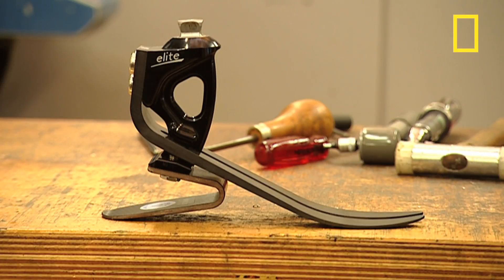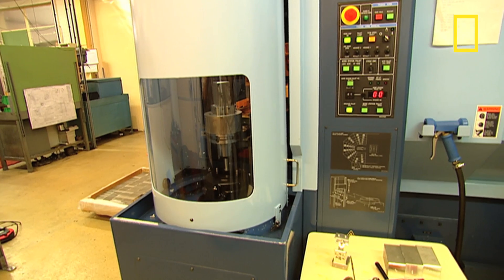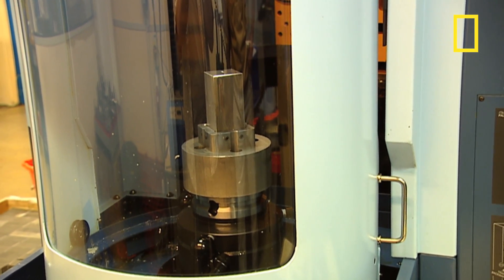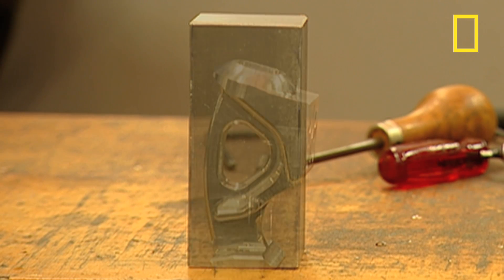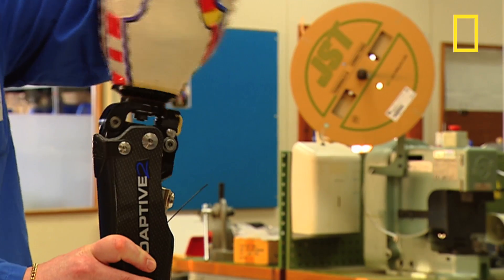Next come the joints. This is an ankle. Strength is crucial, so it's machined from a solid block of aluminium. This is a 5-axis machining centre, one of only two in the UK. The other belongs to a leading Formula One team. It cuts out the ankle joint while fluid keeps the blades cool, from raw aluminium to finished joint. The component parts of the joint are then assembled.